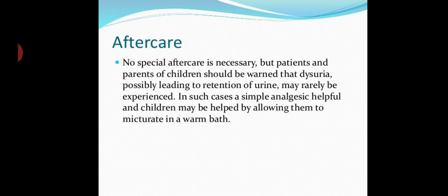Aftercare in MCU. No special aftercare is necessary, but patients and parents of children should be warned that dysuria, possibly leading to retention of urine, may rarely be experienced. In such cases, a simple analgesic is helpful, and children may be helped by allowing them to micturate in a warm bath.